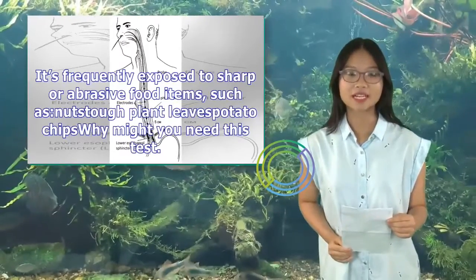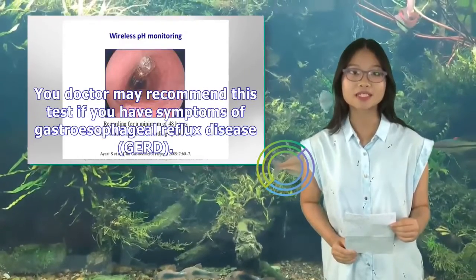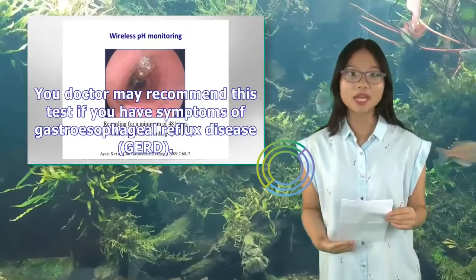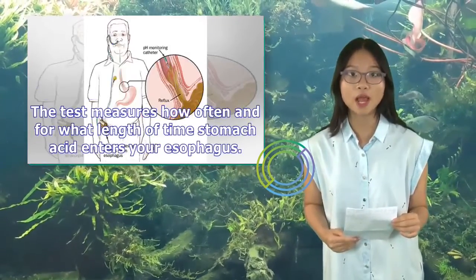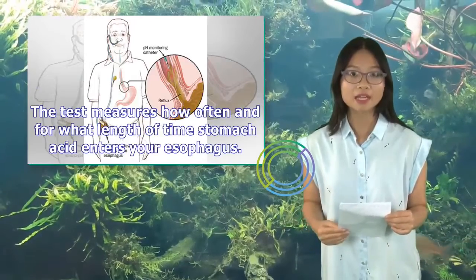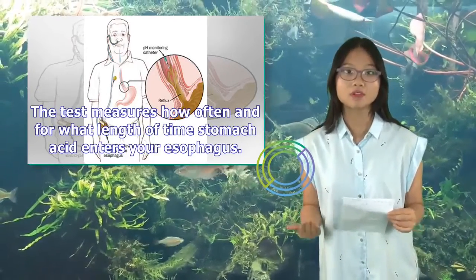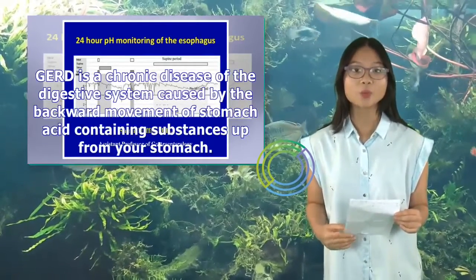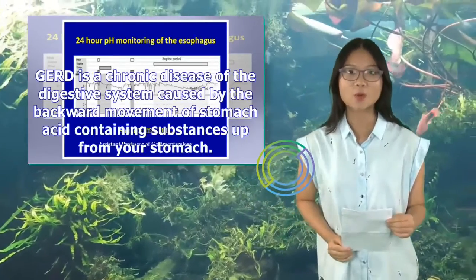Why might you need this test? Your doctor may recommend this test if you have symptoms of gastroesophageal reflux disease, GERD. The test measures how often and for what length of time stomach acid enters your esophagus. GERD is a chronic disease of the digestive system caused by the backward movement of stomach acid-containing substances up from your stomach.